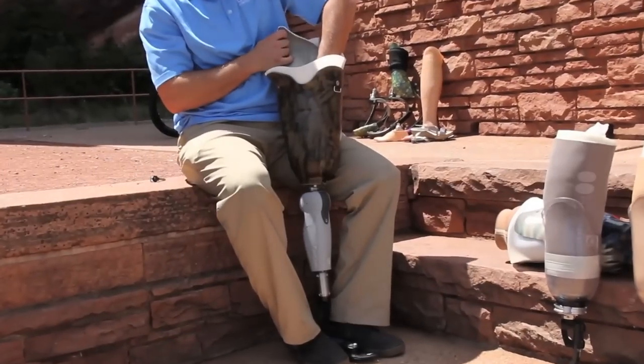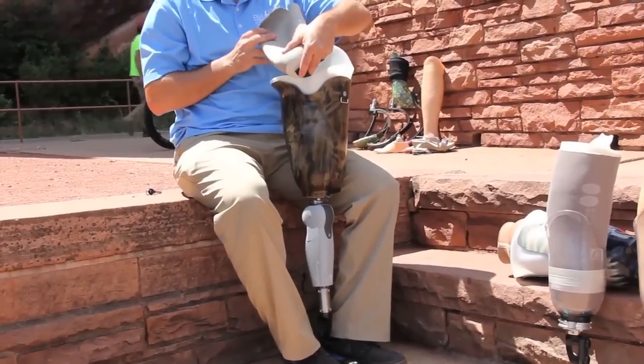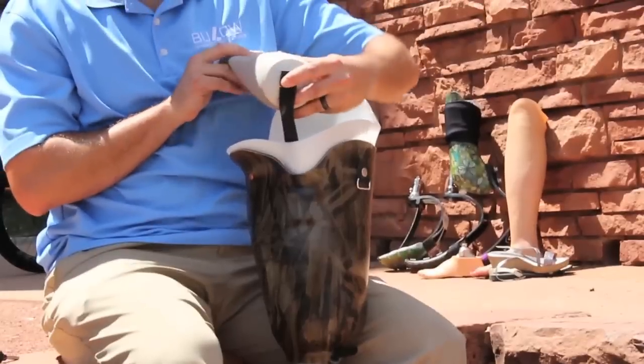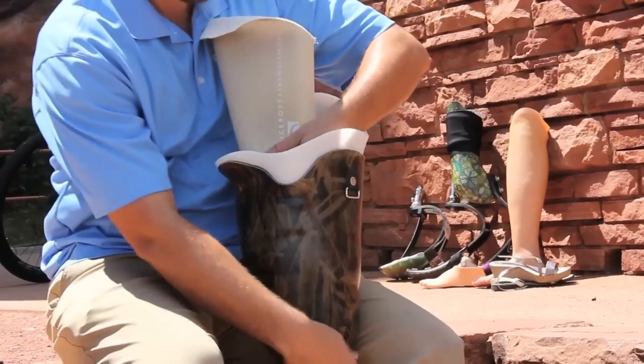Lanyard strap suspension, either transfemoral or transtibial. While utilizing the same type of gel liner — locking type — there is a strap that is screwed into the bottom of the liner.